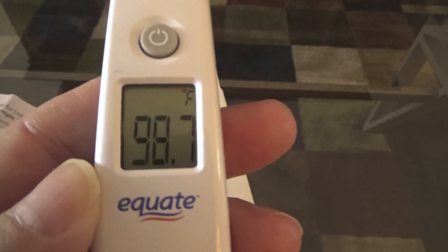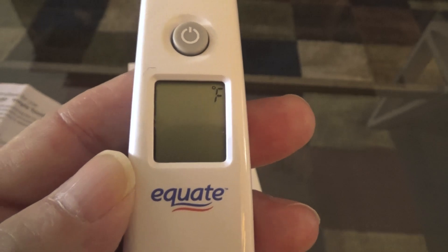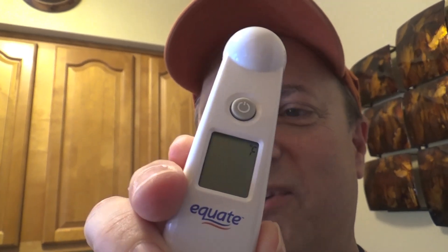You turn it on simply by pressing this on button. That was my last temperature reading — now it's cleared and ready to take your temperature. It's real easy: you just turn it on, wait for the meter to actuate, then point it to the temple of your forehead.